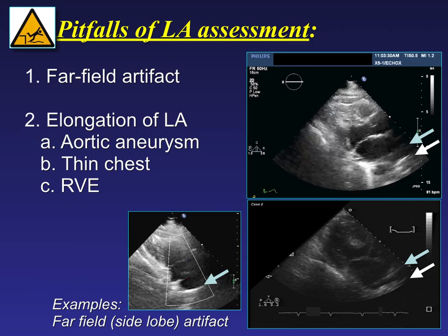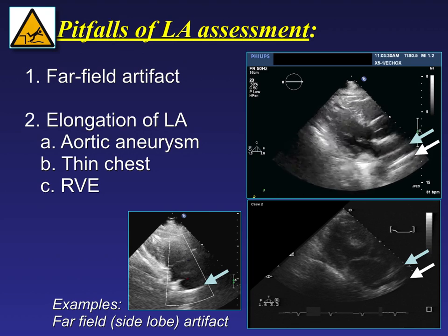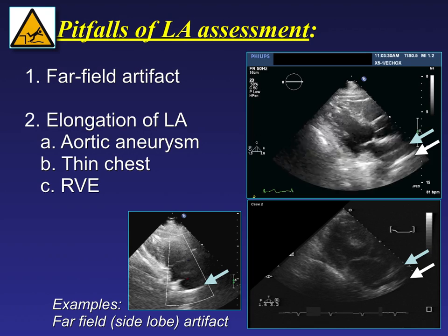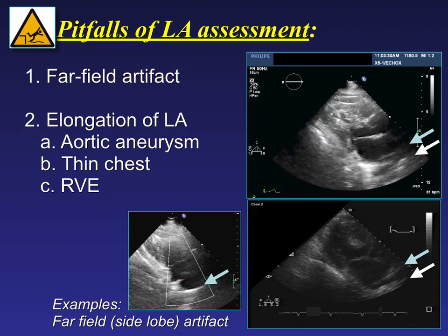I show another image here on the left of the right atrial right ventricle view with a tricuspid valve, and the bright border seen corresponding to the border that you notice on the lower right, projected as a ghost border into the parasternal long axis view.